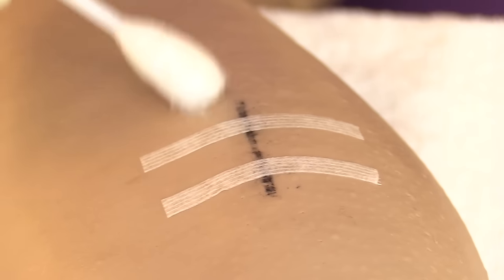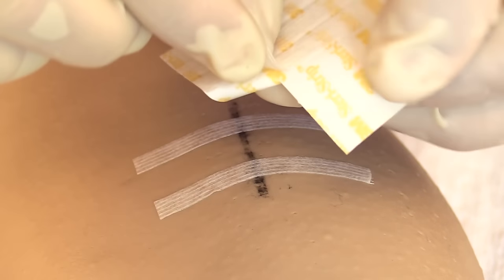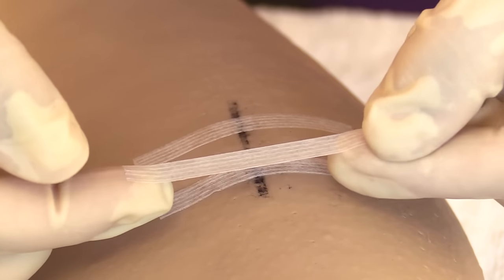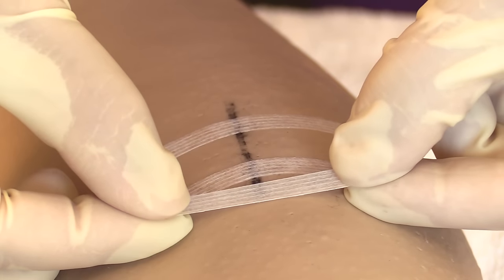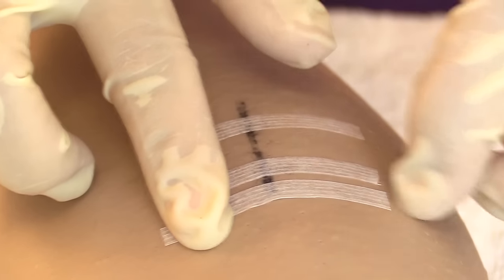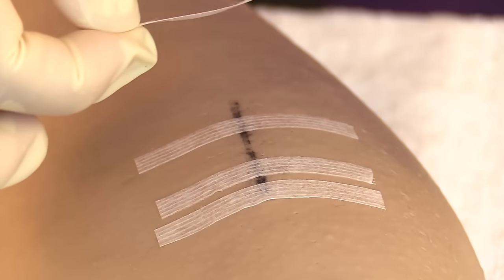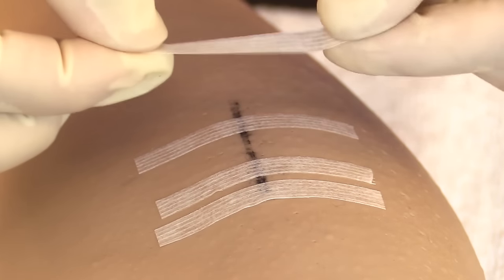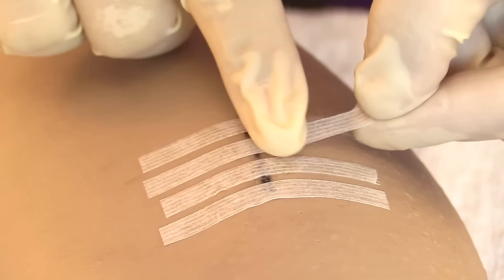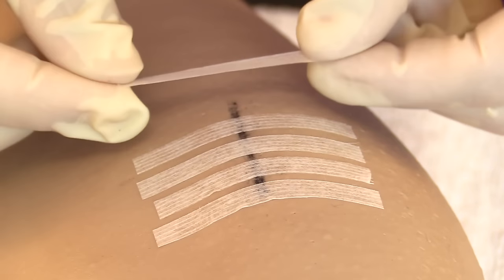Take a new antiseptic swab and clean the areas where the remaining sutures were removed, then let that dry. Once dry, apply steri-strips the same way as before — leaving three-quarters of an inch on each side of the incision and spacing them about one-eighth inch apart. Apply each strip by laying one side down, smoothing it, and then gently laying down the other side.